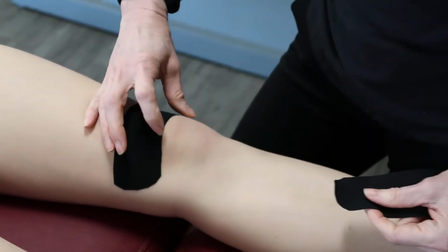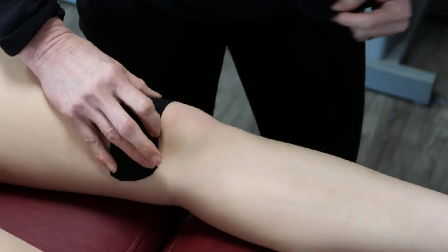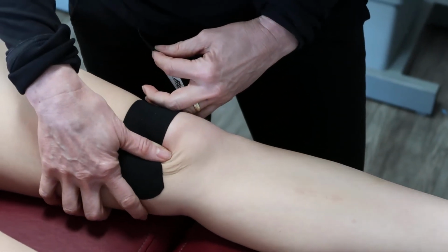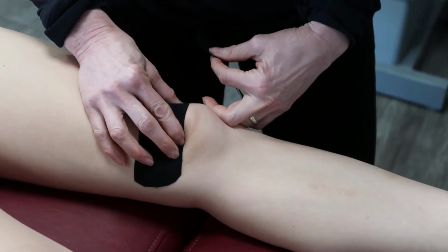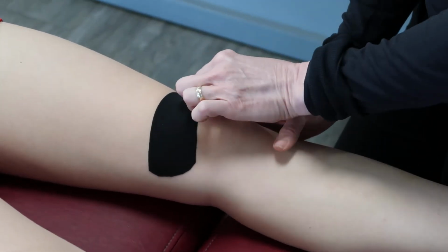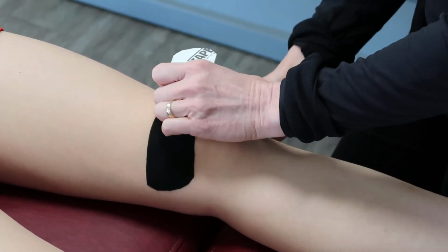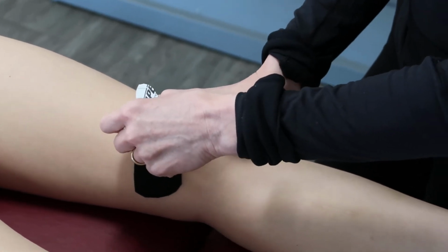For my second strip, I like to do a J strip, and that's just taking the rotational component. So again, the first strip takes the medial lateral rotation, and the second strip is going to take the clockwise, counterclockwise rotation out. So I call it my J strip. Put your base down, and then open up this rock tape. And I like to use rock tape. It has a good adhesive to it, but any tape that you're comfortable with works.